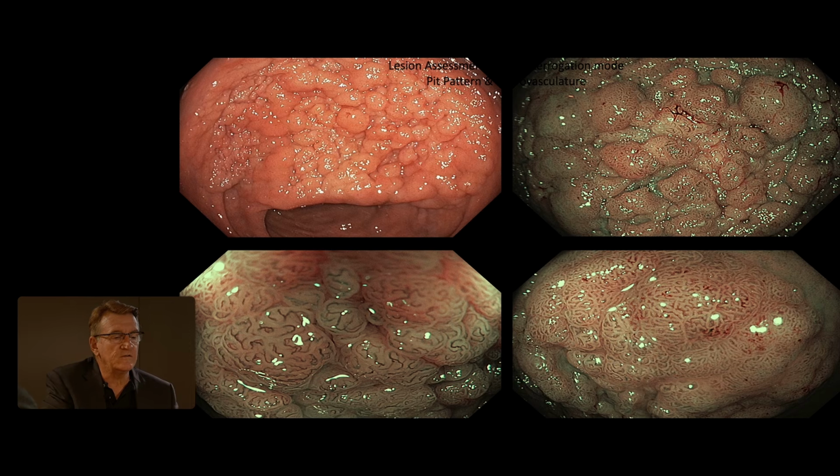This vascular pattern would be even better in your bathroom. Look at it. It's so regular and repetitive. There are no dominant dilated vessels, interrupted vessels, amorphous white patches or anything like that.